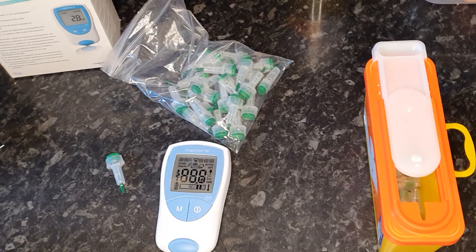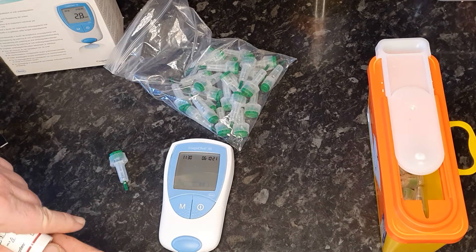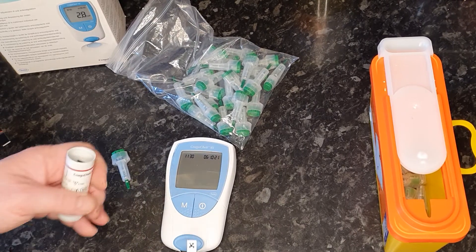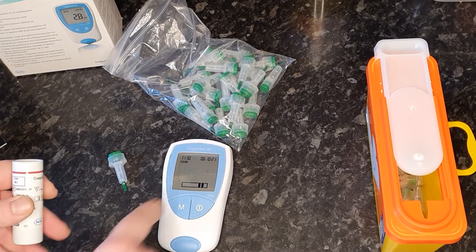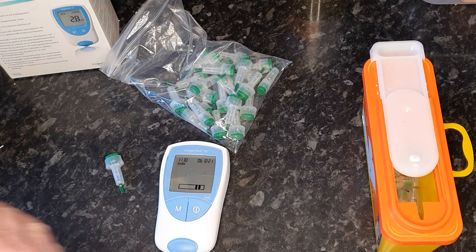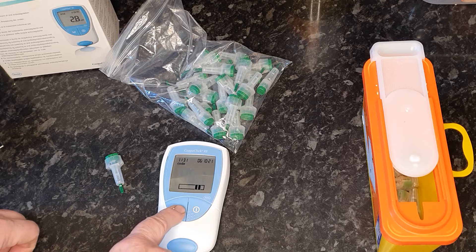You turn the machine on just by pressing on and it will initialize itself, check its battery, and then it will ask for a strip. The strips are coded to the chip inside. So when I insert this strip, it will display the number 461 — that's the code on the chip that's inside the machine as well. So then you press M to confirm.